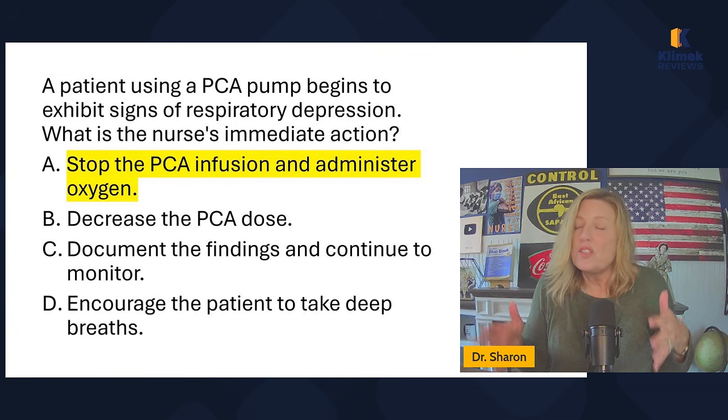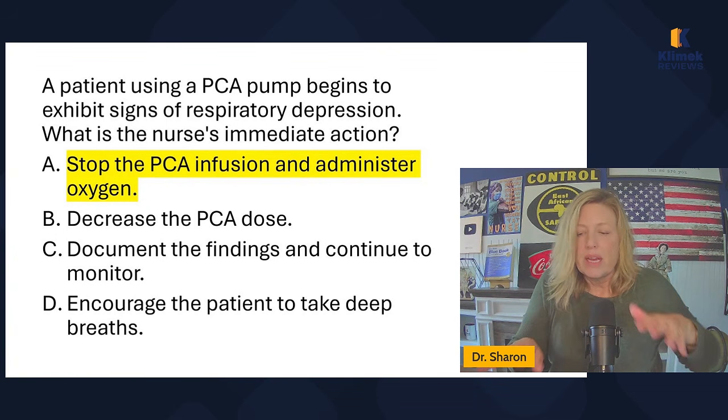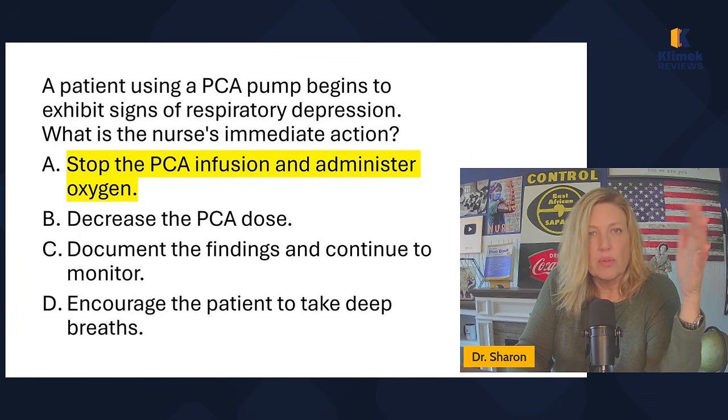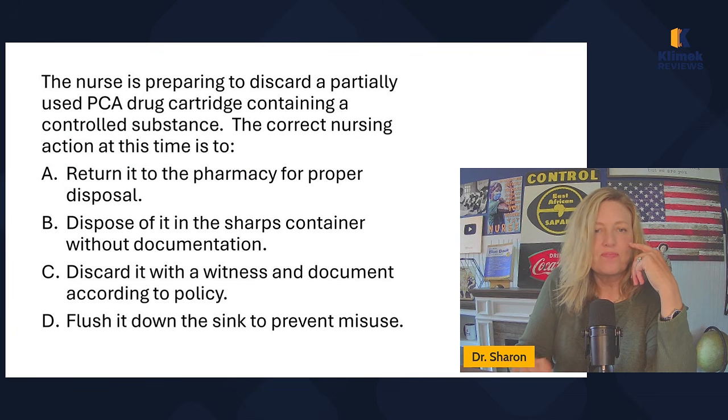If they're respiratory depressed, you've got to stop it immediately. Okay, so just turn it off and administer oxygen or whatever needs to be done, and then reassess where we go from there.